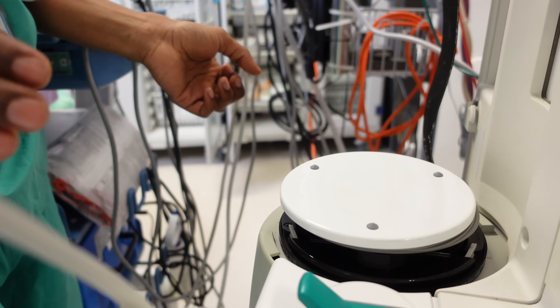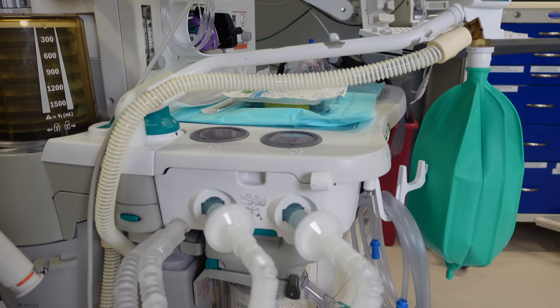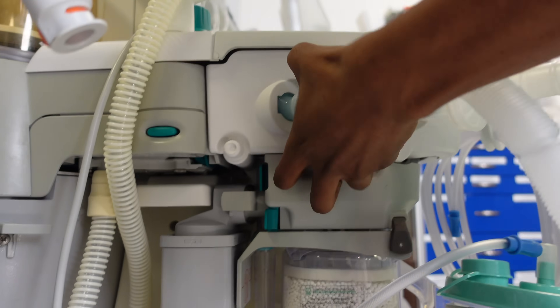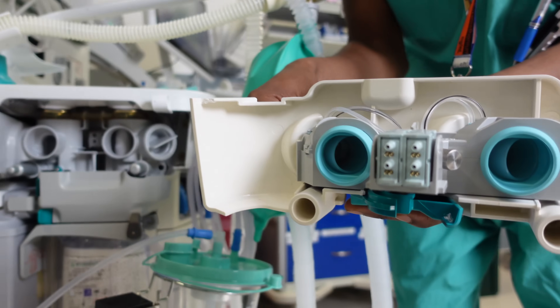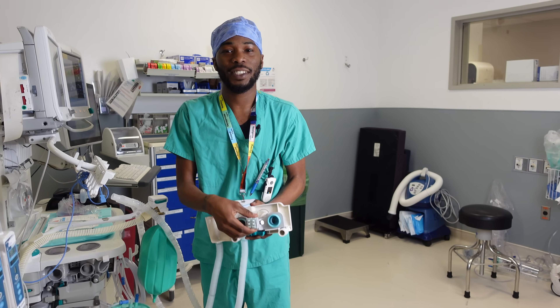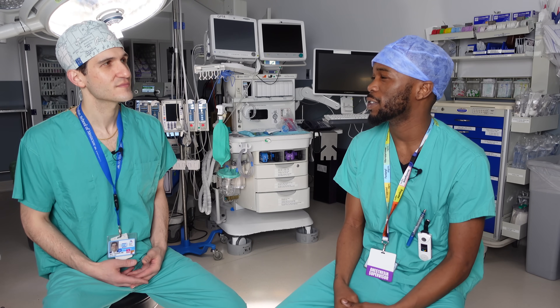How do you learn how to fix an anesthesia machine? This is a complicated piece of equipment. They give us a packet with every machine part, everything that can happen, and then within time you learn. You're not going to get it the first time — within time you get it. You could go to school also; we have little programs that people go to to become an anesthesia tech.